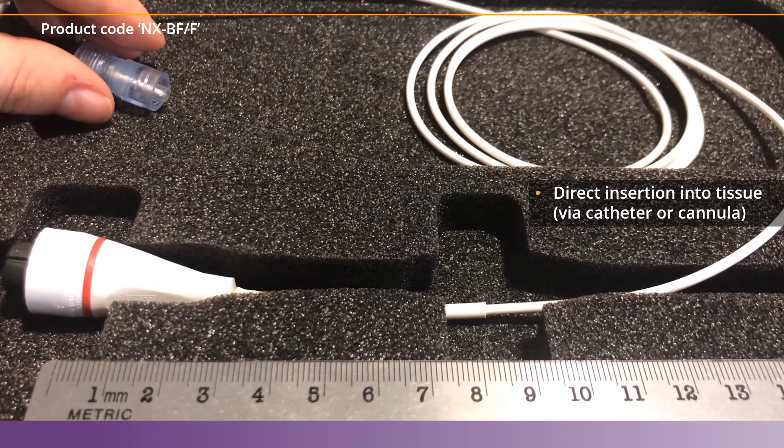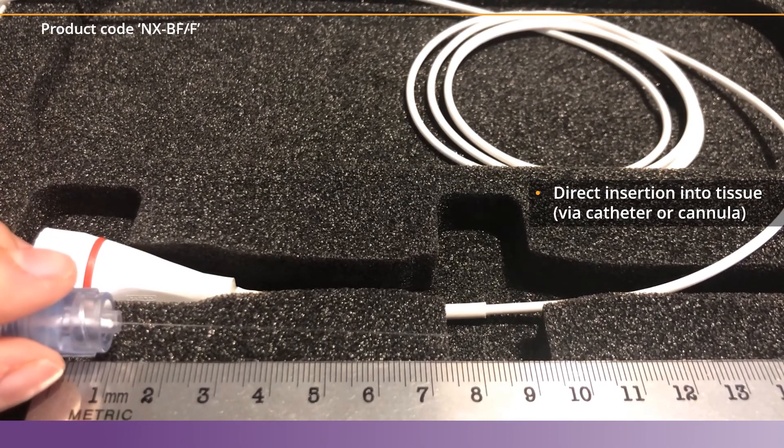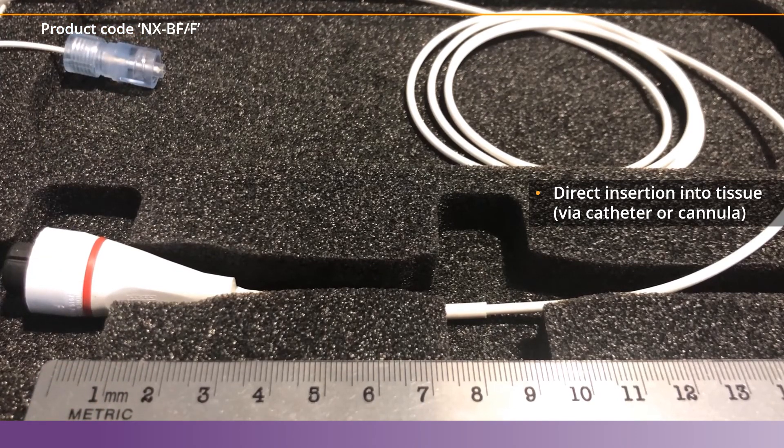As you can see in this video, the fiber is very, very thin — it's almost hard to see unless you notice the light reflecting off of it. These fibers are somewhat flexible, but are really meant to be inserted straight into the tissue with an introducer, like a cannula or a catheter.